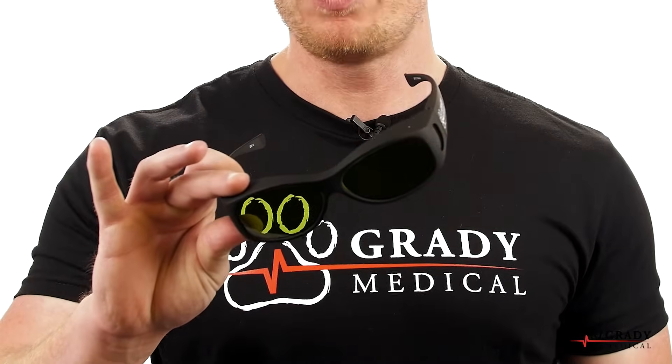Always ensure that everyone in the room is wearing the proper laser safety eyewear. These glasses block out special wavelengths that normal sunglasses do not.